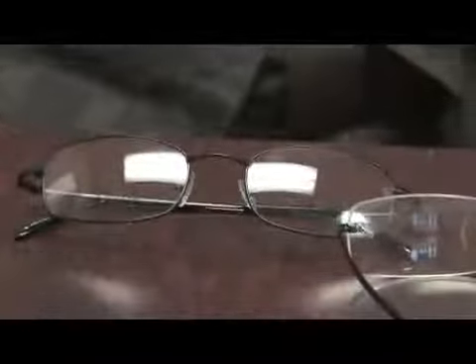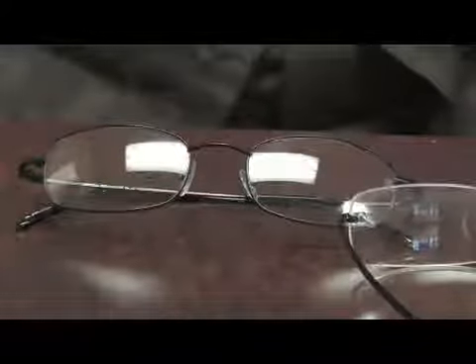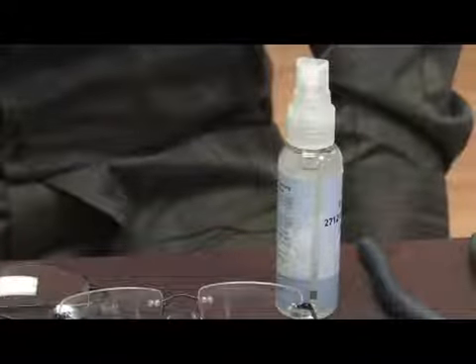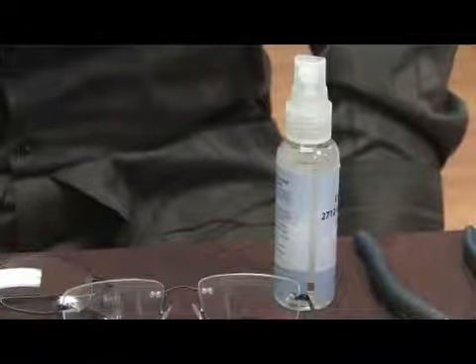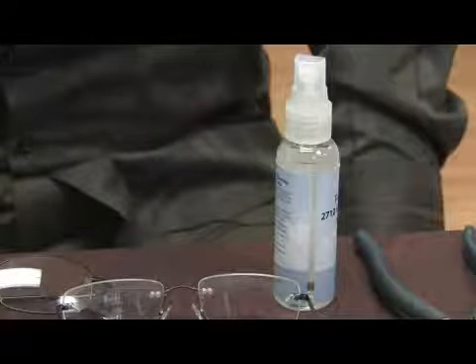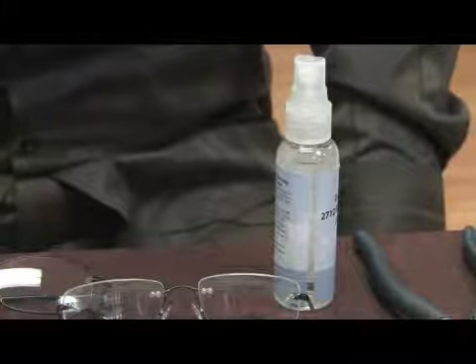Okay. And that's for women, if you have mascara and your eyelashes touch the lens, you definitely want to use the solution. The solution is, I think, more for something that has a tough stain to get out, a chemical or something like that. Ideally the cloth will work absolutely fine if you have just your average cleaning. You don't have to grab the solution. You can just wipe them clean with a soft cloth. But if you do have something hard to get off, use the solution. That'll work just fine.